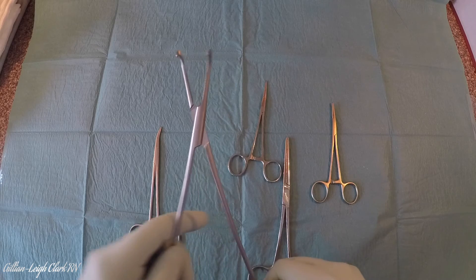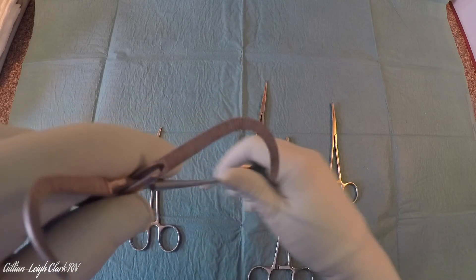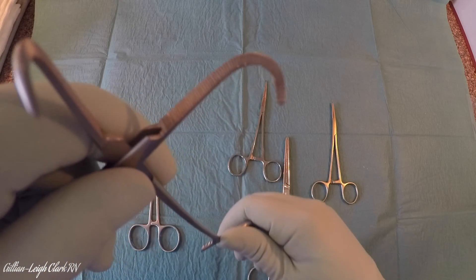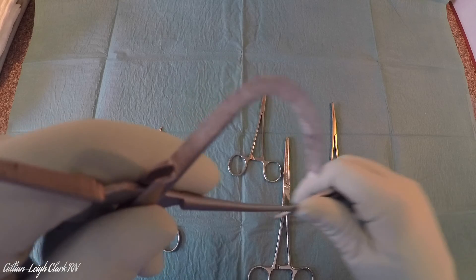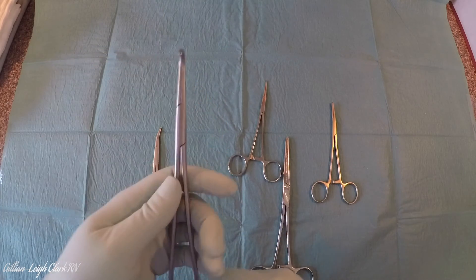Here we have a Negus, much like a Leahy or Shaughnessy. Again, with the same striations for grip. So it is an artery forcep — it is a clamp.